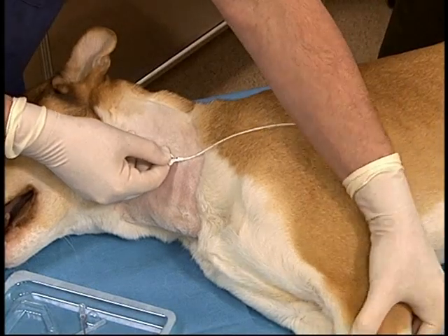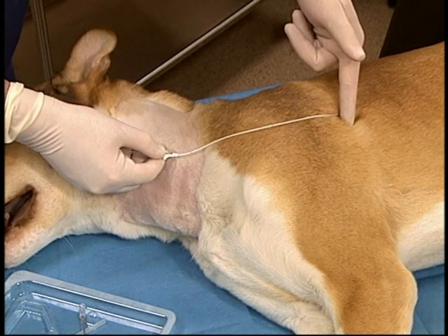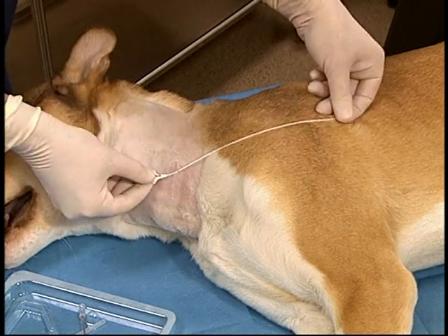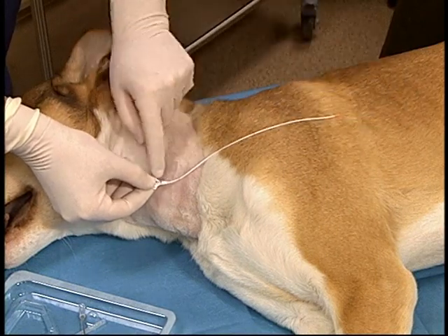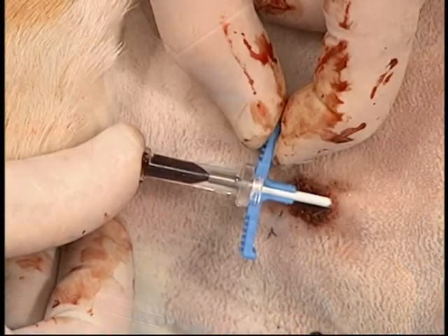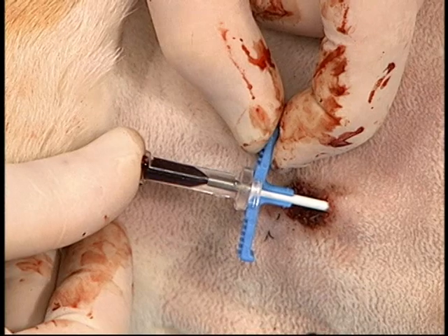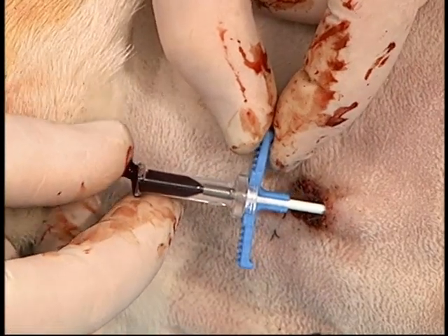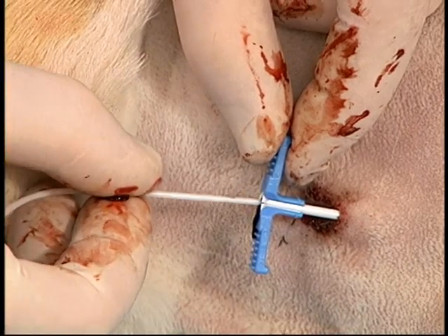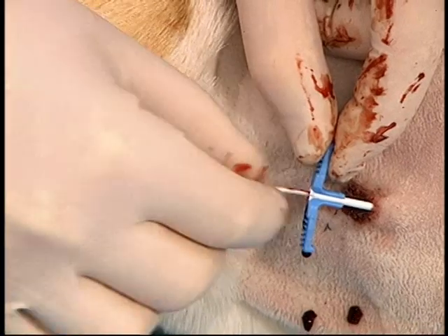The catheter is pre-measured to an appropriate length, which is approximately the fourth intercostal space when using the jugular vein, in order that central venous pressure measurement can be done. An imaginary line is drawn from the caudal aspect of the elbow with the limb in a neutral position up to a level that is in line with the venotomy site. The peel-away sheath with its stylet are inserted through the skin and then into the vessel. The stylet is then removed and the catheter is inserted through the center of the peel-away sheath, to the pre-measured location.